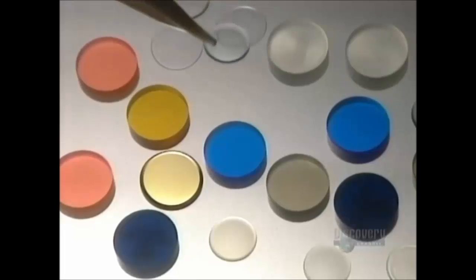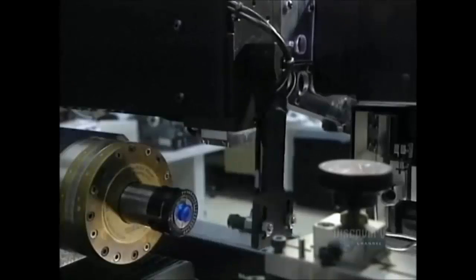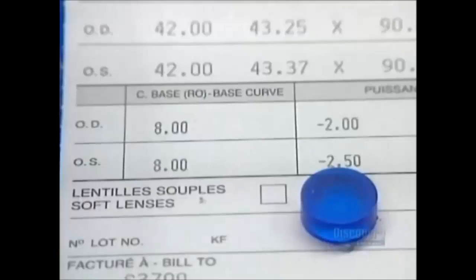Contact lenses have been in existence for over a century. At first completely rigid, they have now become gas permeable and as flexible as gelatin. These small polymer discs are used to make soft polymer contact lenses in a variety of colors.